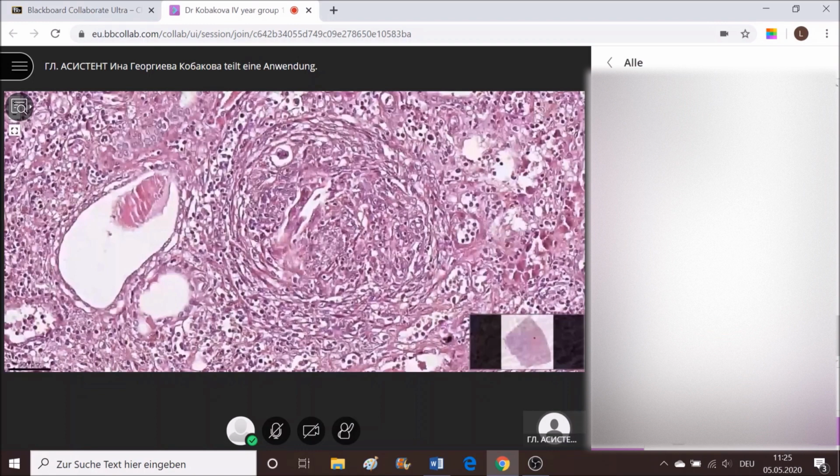What was crescent glomerulonephritis? How did we think of this one to happen? What is the glomerulonephritis as a process itself? Take a look at the slide. Well, do we see any kept healthy glomeruli? No, they're all affected by the process. It's because it's hypersensitivity third type reaction. It's in the complex of autoimmune reactions. We observe changes in all of the glomeruli.